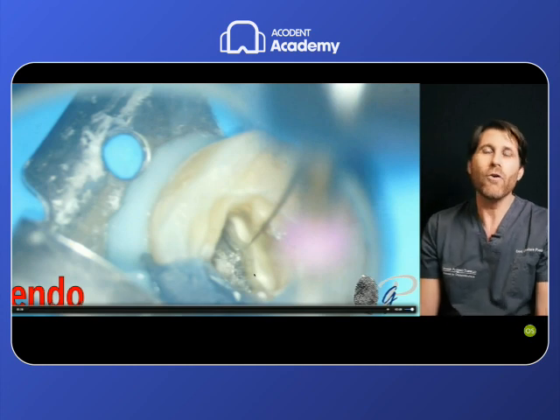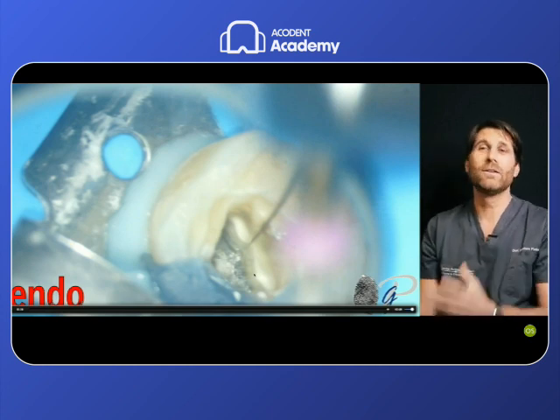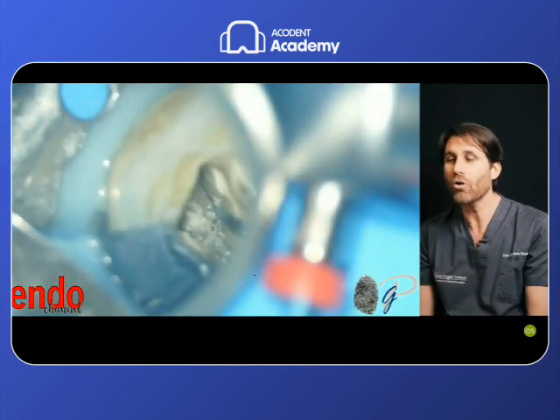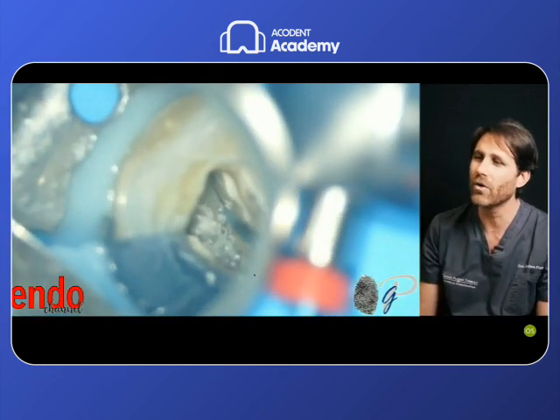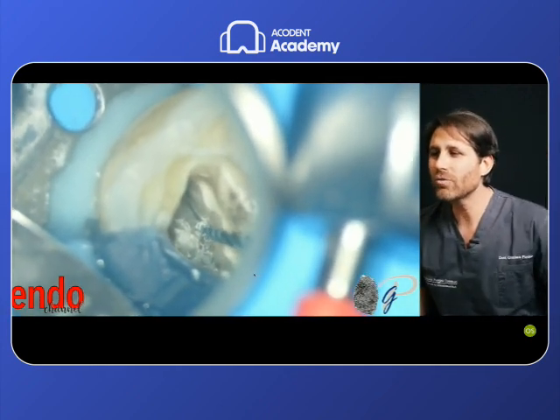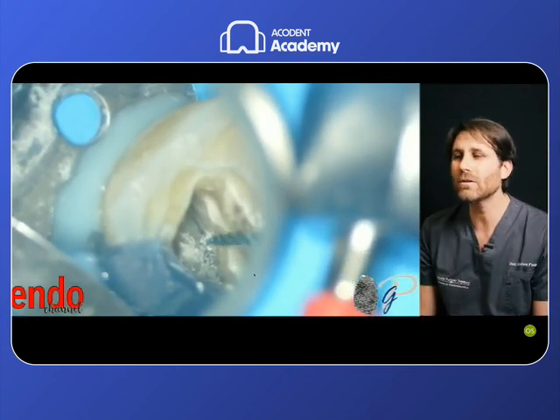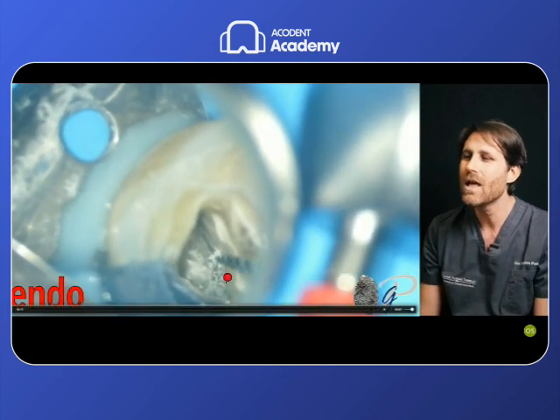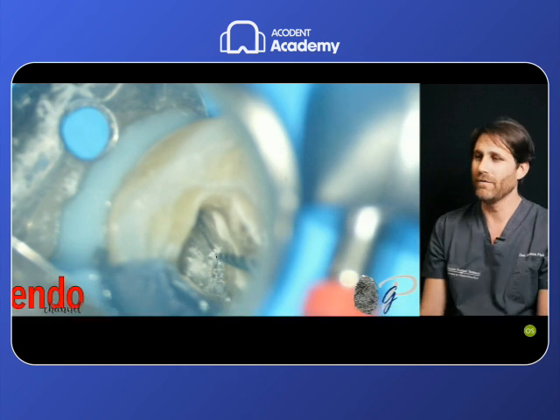So, following my instruction, I then used a single file, a bigger single file, to overcome the coronal problem, the Reciproc Blue file. So here, I tried with the tip of the Reciproc Blue file. I started to try penetrating it, but it was not so easy to penetrate. Again, it starts to cut, you can see the dentin debris, but not penetrating the orifice.